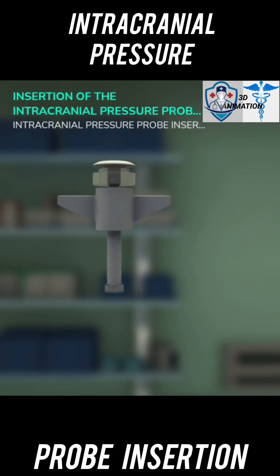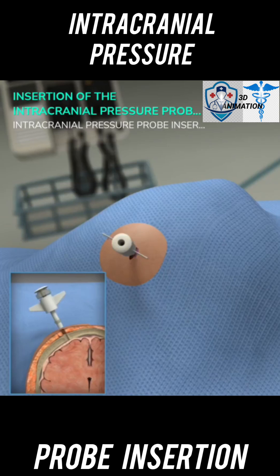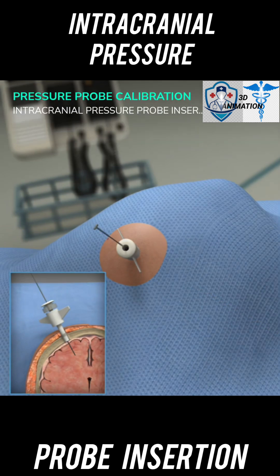Screw the bolt stop onto the bolt at a depth corresponding to the previously estimated skull thickness. Screw the bolt clockwise into the burr hole until the bolt stop is seated at the skull. Ensure that the scalp is not pinched between the bolt stop and skull. Insert the stylet into the bolt and beyond the dura to clear the passage for the fiber optic probe.